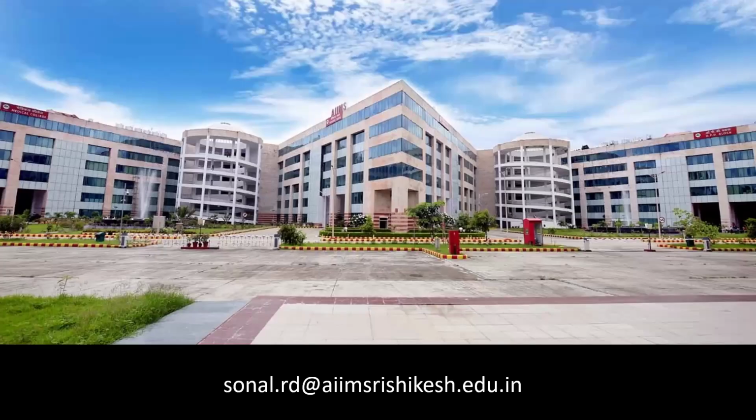So this was all about the imaging anatomy of ankle and foot on radiograph and MR. And we also saw the osseous anatomy, ligamentous anatomy, anatomy of muscles, and anatomy of nerves in the ankle and foot. So that's all for today. Thank you.